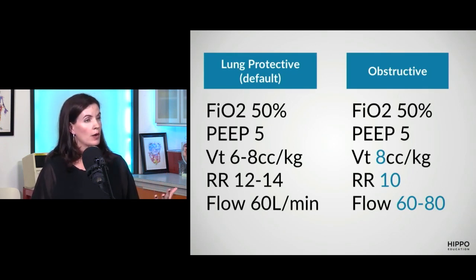Guys, can you tell me why would I want to slow it down in COPD patients? For me, the way I think about it is that they can contain a lot of air, but their problem is, I think of the wheezing. It's like they just can't get it out. It's almost like breathing through a straw.